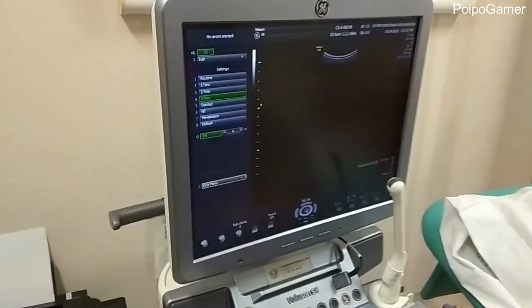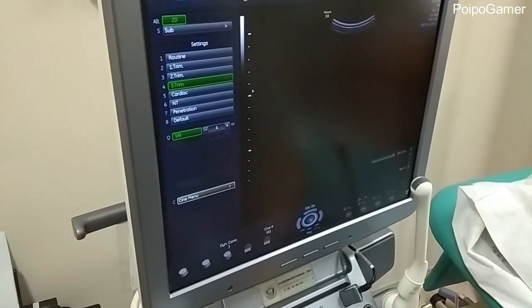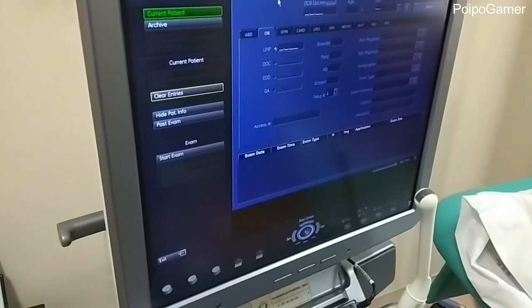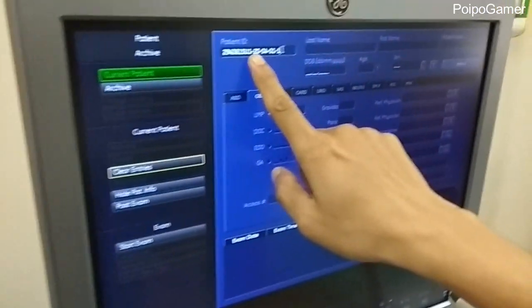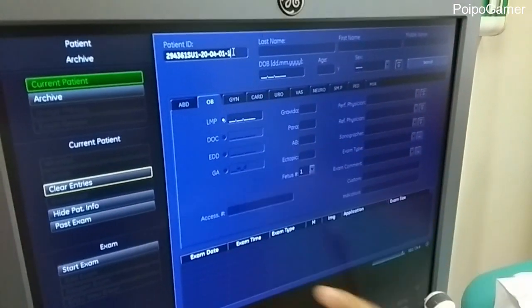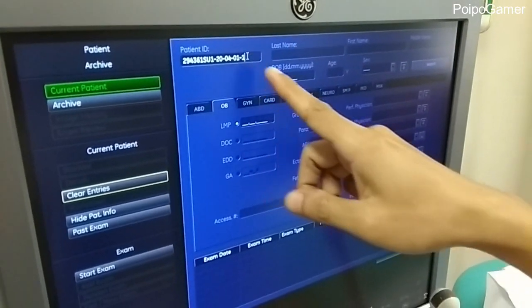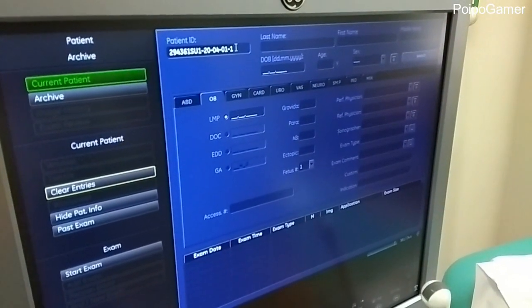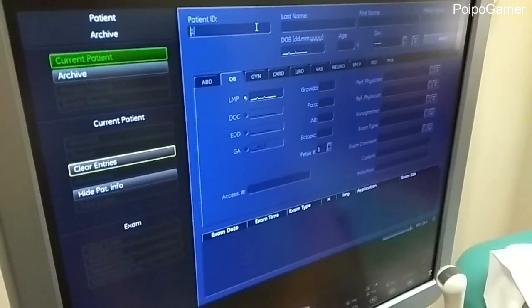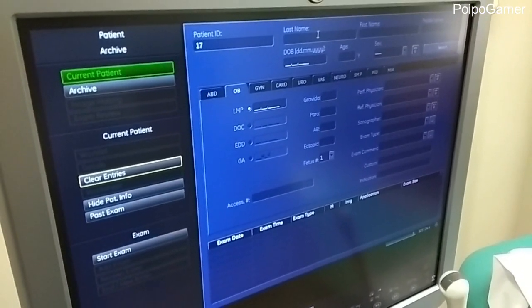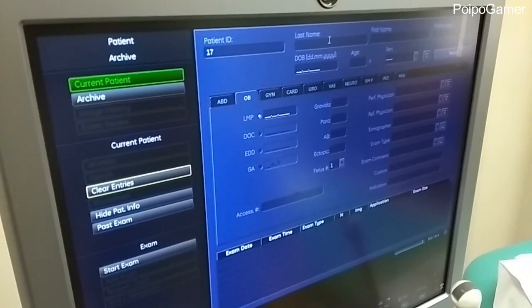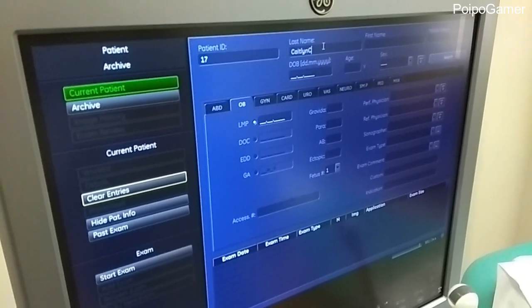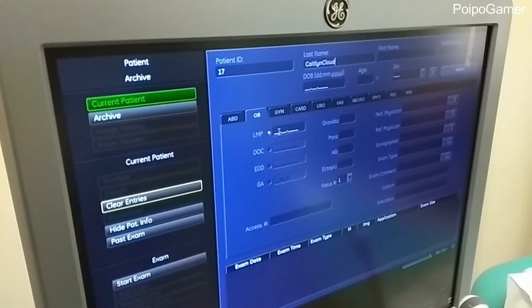So, for example, I'm gonna create a new patient here. So I just gonna click this. And... this is the patient ID. This patient ID should be the same with the patient ID that you're gonna use in the HPP. So, for example, I'm gonna use 17 here as the patient ID, and the name is... Katelyn.